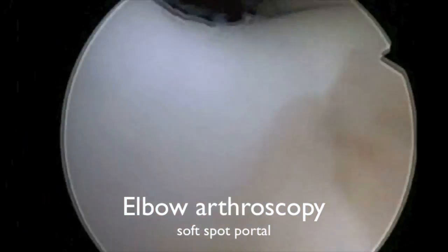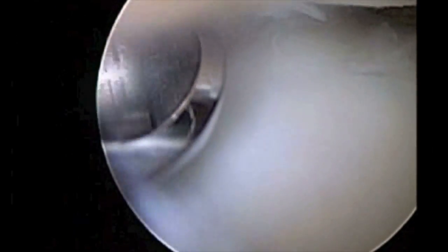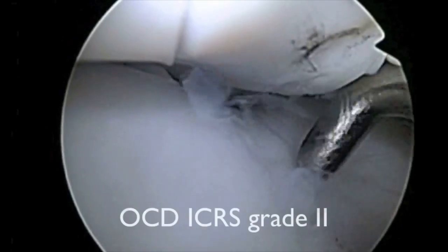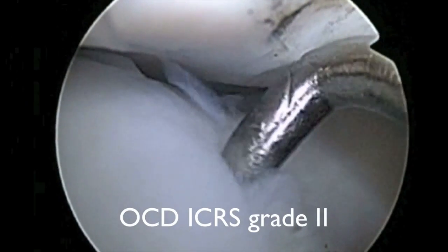Here, the scope is viewing from the soft spot portal, and a shaver and radiofrequency probe were utilized for optimal visualization. The radial head can be seen at the top of the screen.